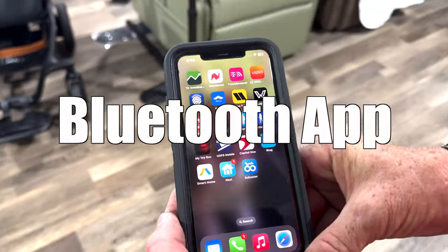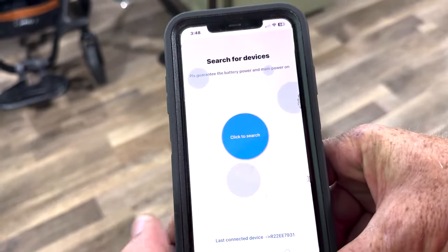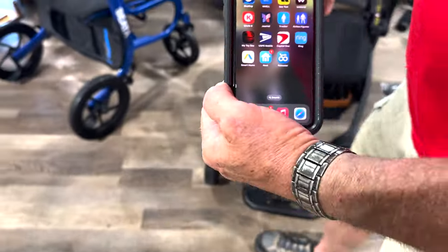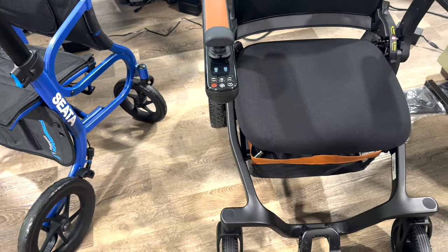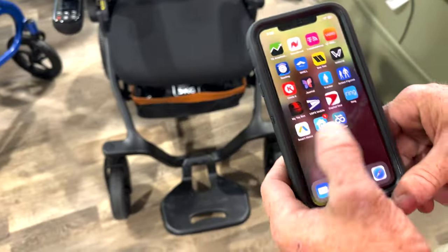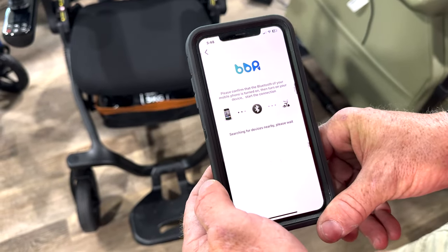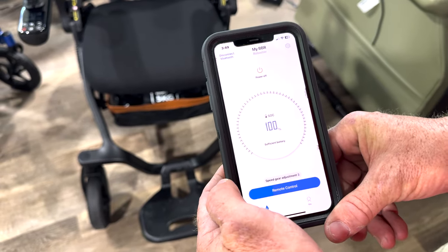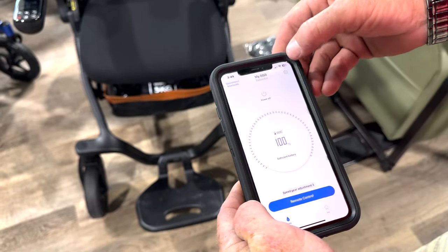All right, so download the app for the new Robooter. Once you get that downloaded, you gotta have the power chair on. It must be locked to run it. Locked. Okay. Turn that on. Press that. Wait for it to connect. Bluetooth connected. It just said Bluetooth connected. There you go. Okay. You got to go in your settings.